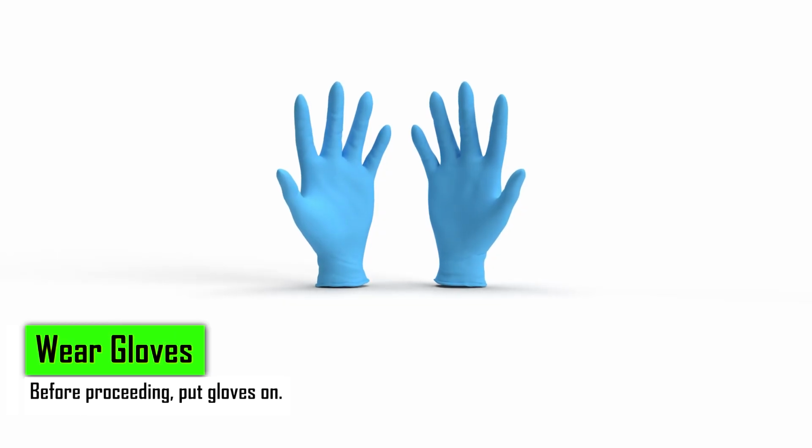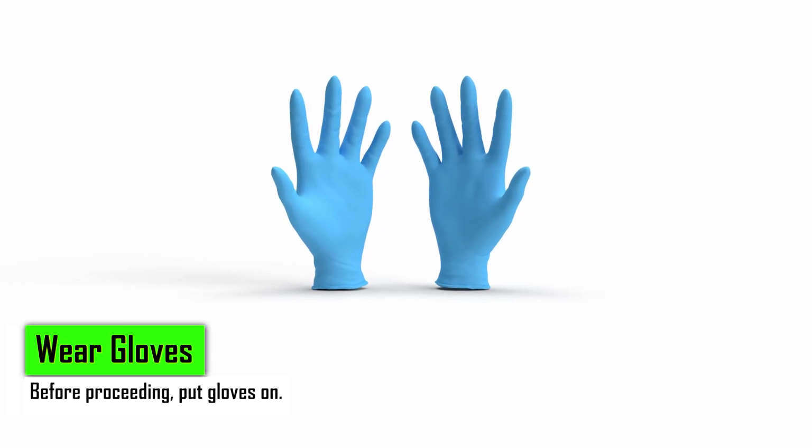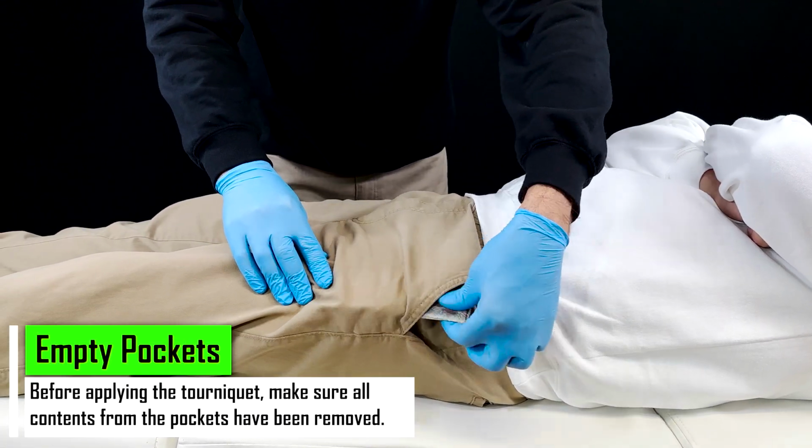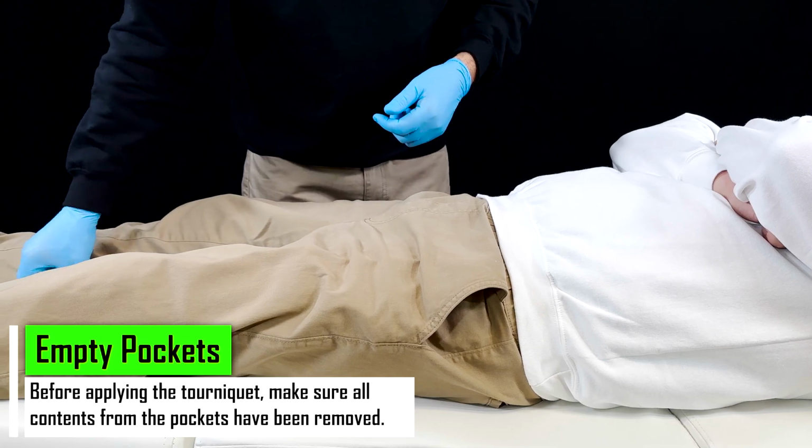Wear gloves. Before proceeding, put gloves on. Empty pockets. Before applying the tourniquet, make sure all contents from the pockets have been removed.